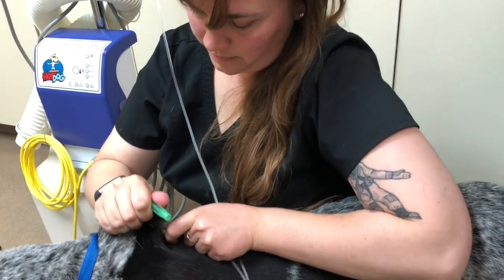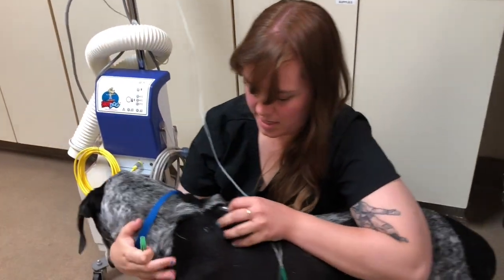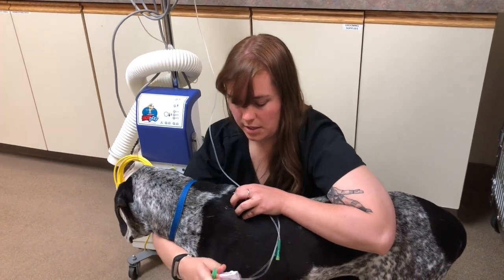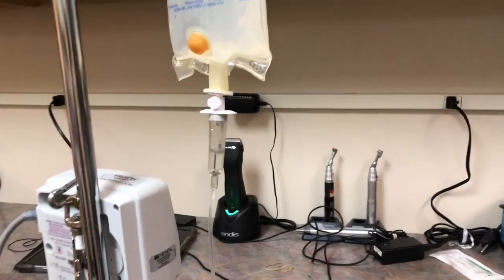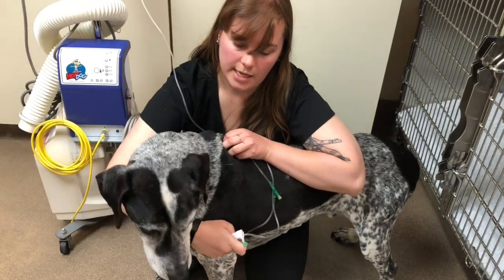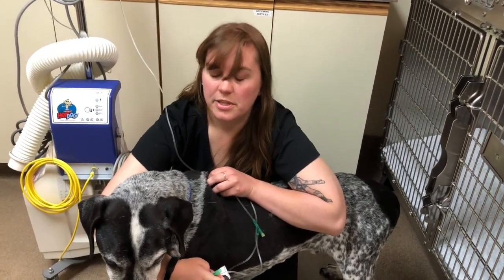I know, sweetie. You're okay. So now I have my needle set. I can unclamp. And my administration set is dripping, and Austin can easily take up to 1 liter of fluids. He technically doesn't need it, but with a patient of his size, he could take up to that much.